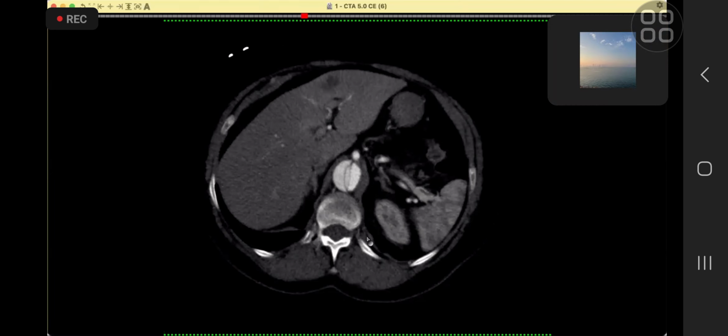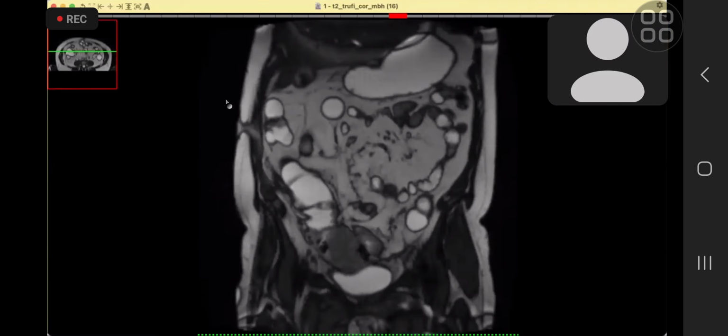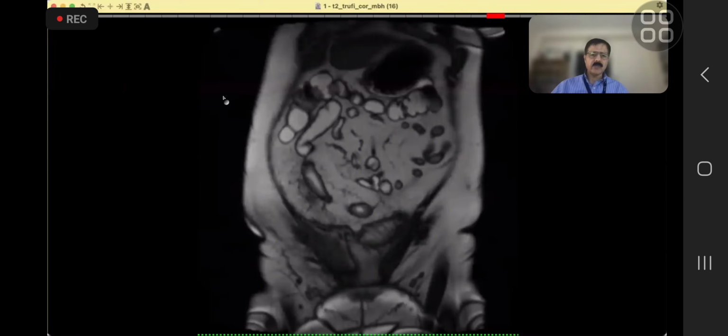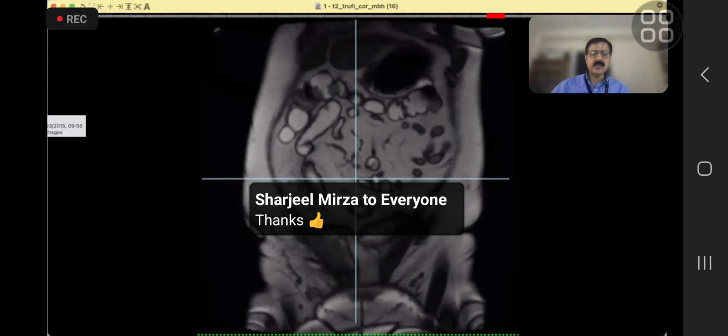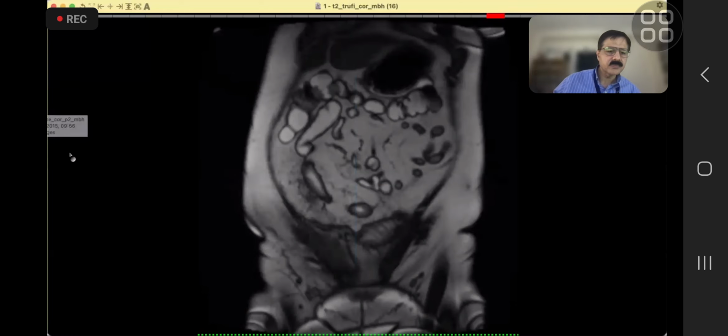Yes, Dr. Khan, I'm here. Okay. Do you do MREs? Yes, sir. So I am going to show you an MRE, right? Yes, okay.